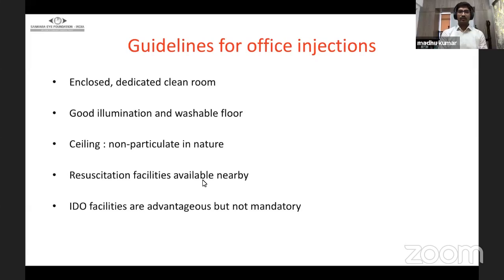We need to have an enclosed dedicated clean room, good illumination and a washable floor. The ceiling needs to be non-particulate in nature. The resuscitation facilities need to be available nearby. And an IDO facility is advantageous in some eyes where we need to check for the arterial pulsations.